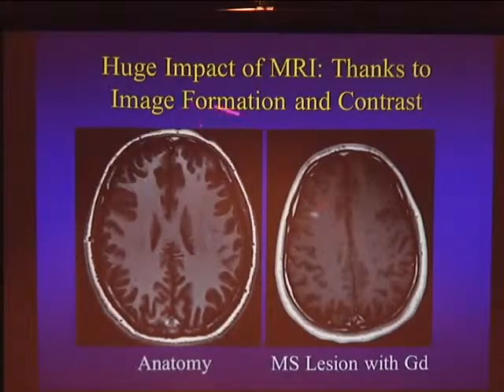And the reason for MRI is because of the way MRI makes images, you can get this spectacular resolution. Right now, spectacular for radiological techniques, terrible for light microscopy techniques. But here's your typical millimeter resolution image of the brain. And not only can we make images at high resolution, but the contrast is spectacular, this showing the white and gray matter. Sometimes contrast is due to the tissue properties, and sometimes due to added agents.